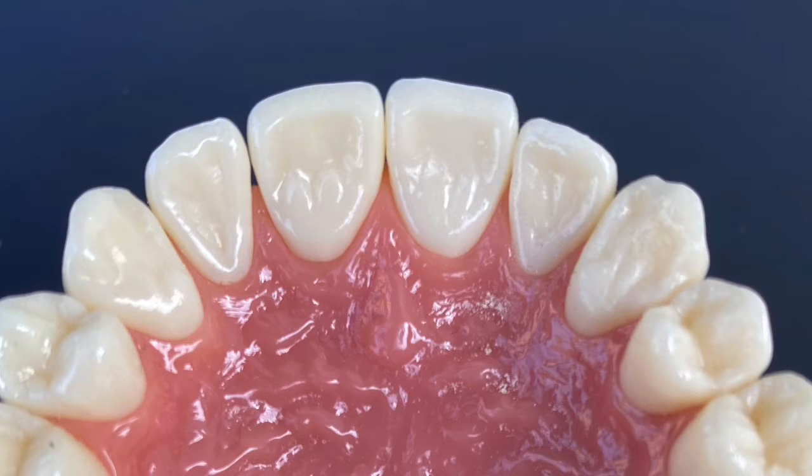Today in clinic, we will be prepping number 9 mesiolingual and distolingual for a class 3 composite restoration. In this video huddle, we will go over this preparation, contouring, and polishing this restoration.